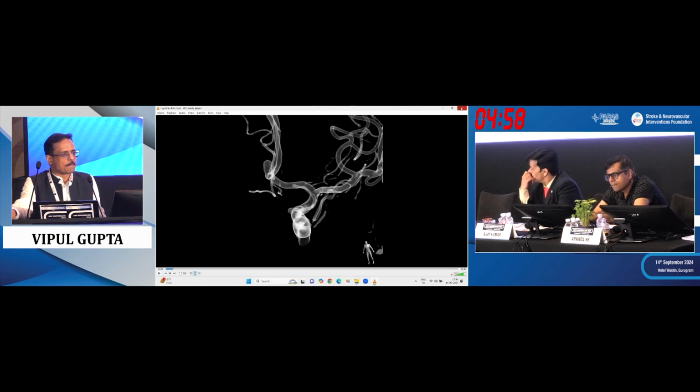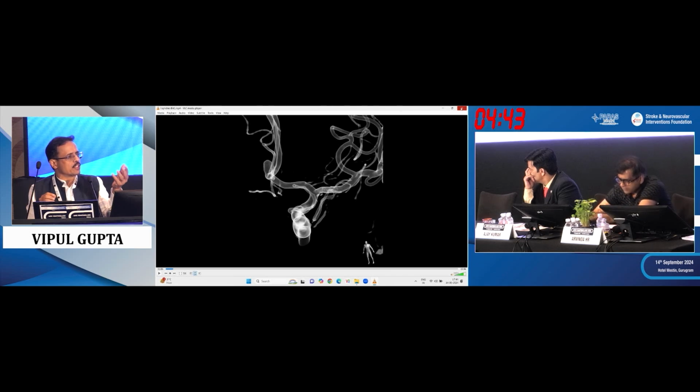Yeah. So while removing the microcatheter, is there any threat to the coil mass, if the catheter is too much shaped, bent too much? What about the coil mass while removing the catheter? Okay, that's a very important question. Not the shape, but yes, when removing the microcatheter, these are not very soft coils, and they can pull back the coil loops a bit.